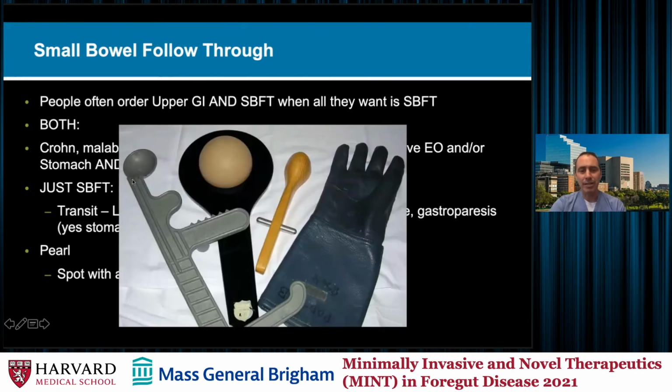The F-spoon is this gray one here that looks like an F. It was made by a guy named Frank. That is true. I don't know whether that's why he called it an F-spoon, but it really just gives us good leverage without getting our hand in the field. In the olden days, you'd see people put on one of these radiation gloves and put their hand in the middle of the field. The radiation glove is to protect my hand when I wear the F-spoon. It is not meant to go on the patient.